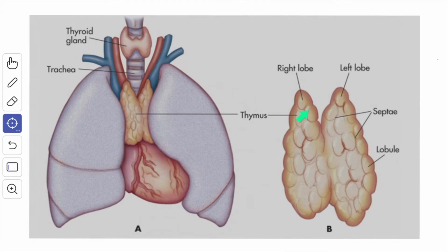Each lobule is about 2 mm in diameter and has an outer cortex and inner medulla. Both the cortex and medulla contain cells of two distinct lineages, which we'll see in detail below, and the medulla of the adjoining lobules is continuous.